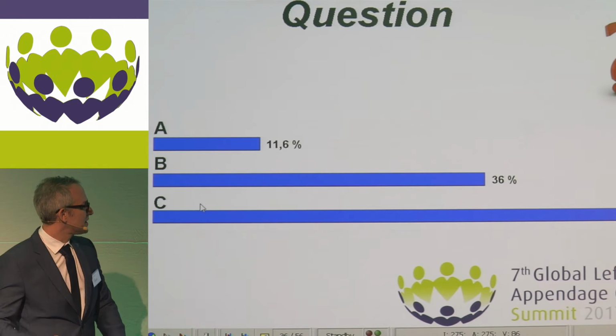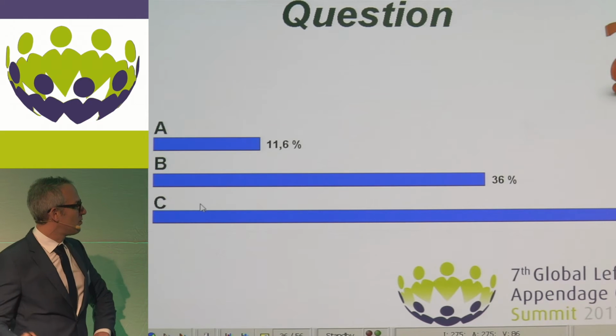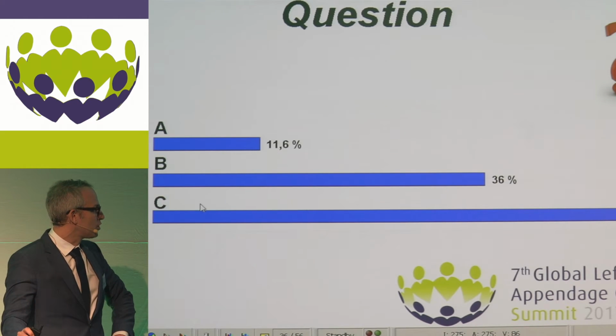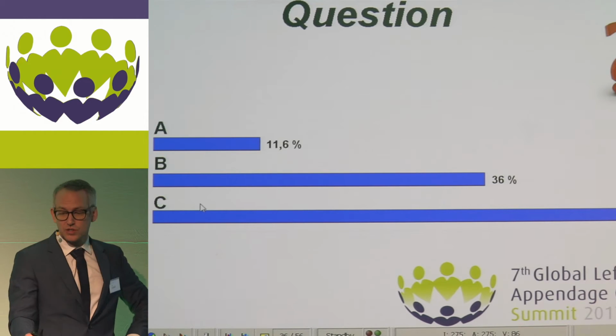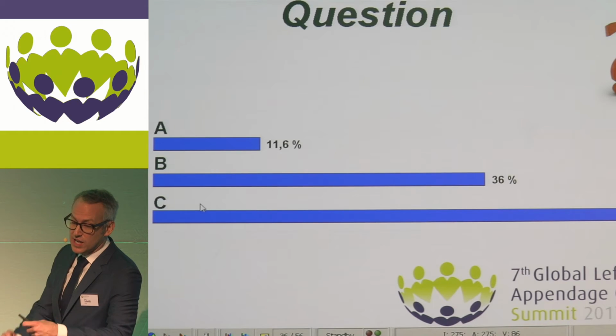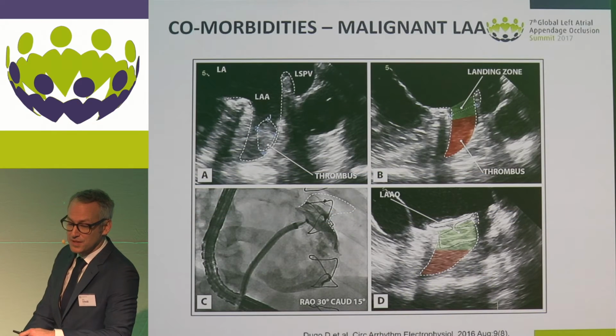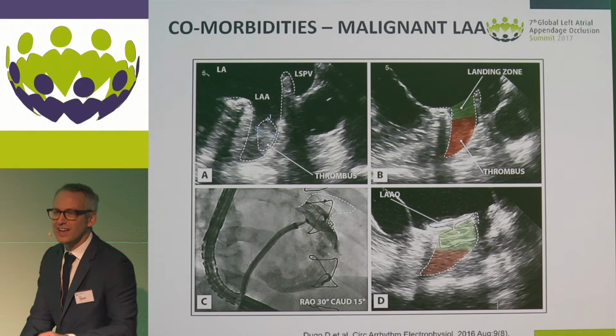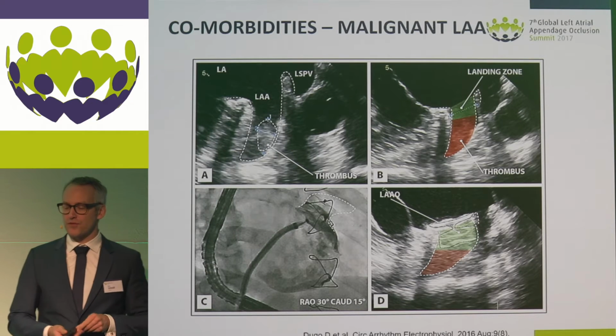Okay, yeah, interesting. So 10% or roughly 12% would send the patient to surgery, 1/3 would go for occlusion, and then half of you would continue drugs. However, I think it's a good option. However, in this gentleman, most of the NOACs had already been used. So we were really desperate and decided to go for B. So we decided to put a device on top of the thrombus.